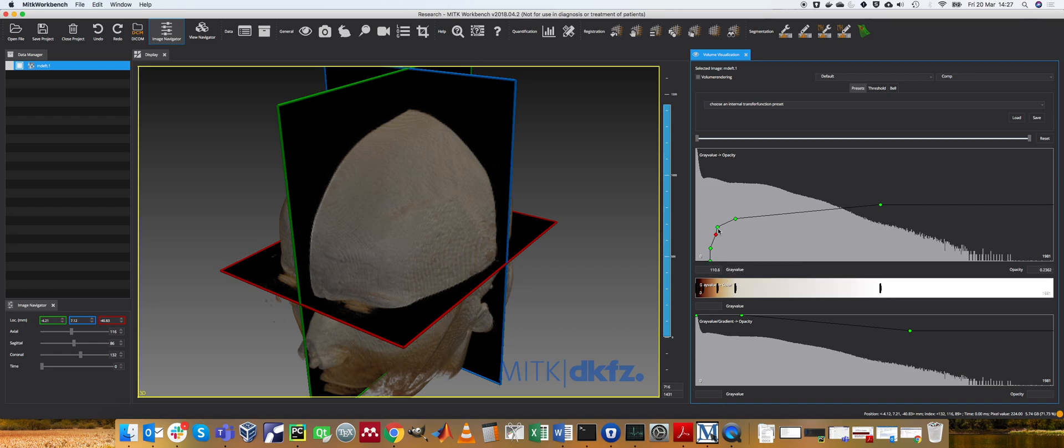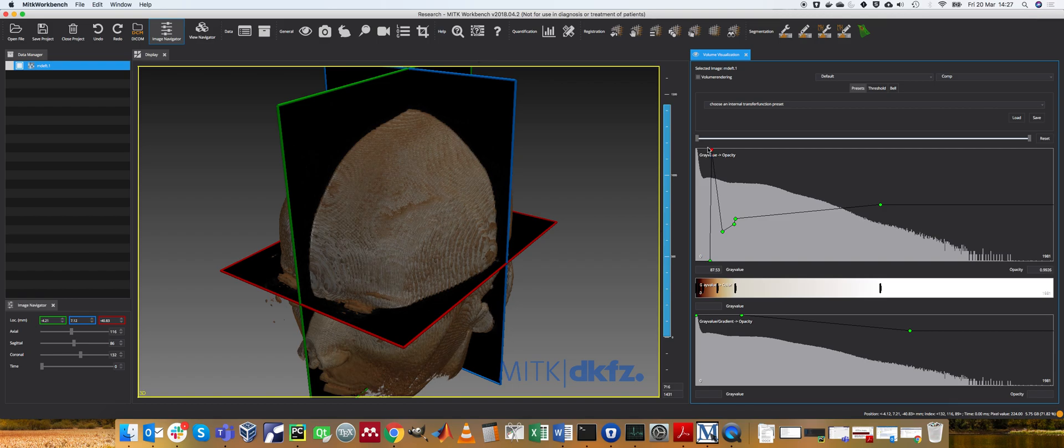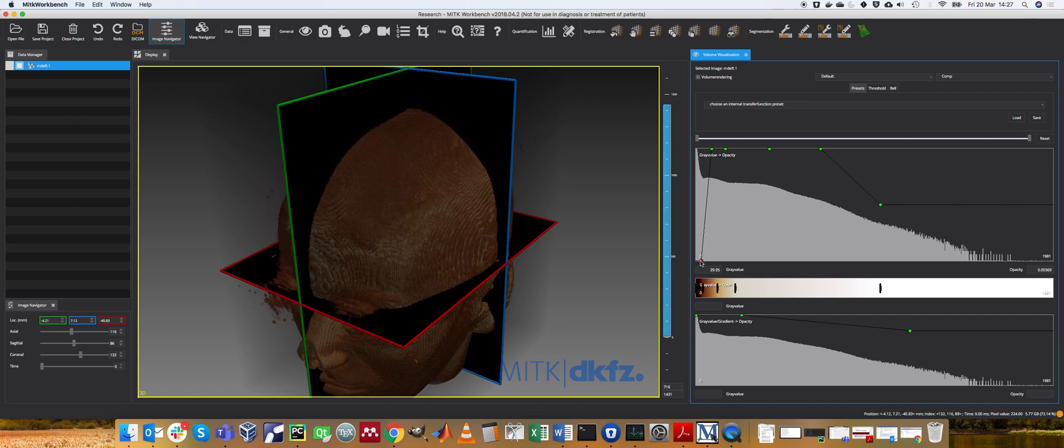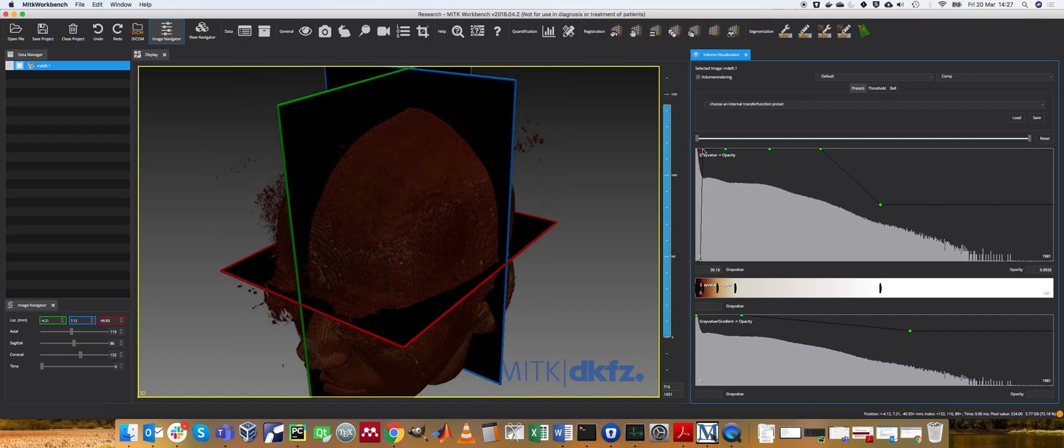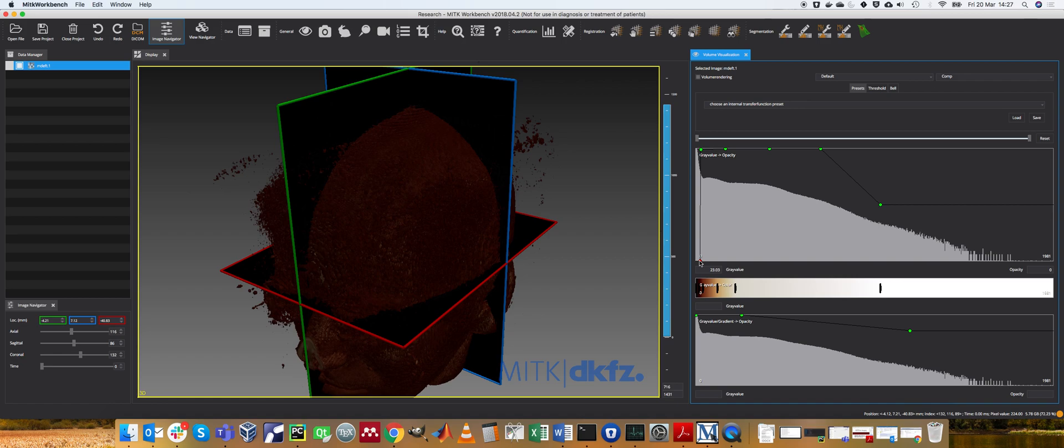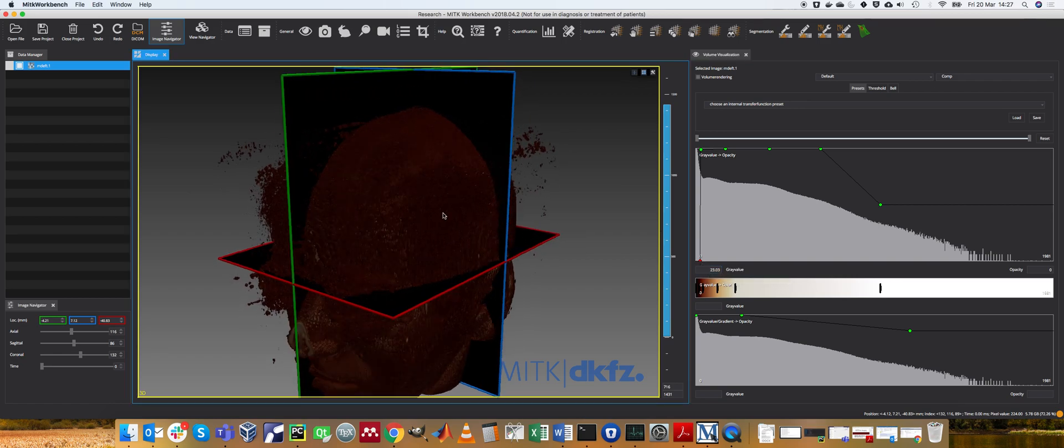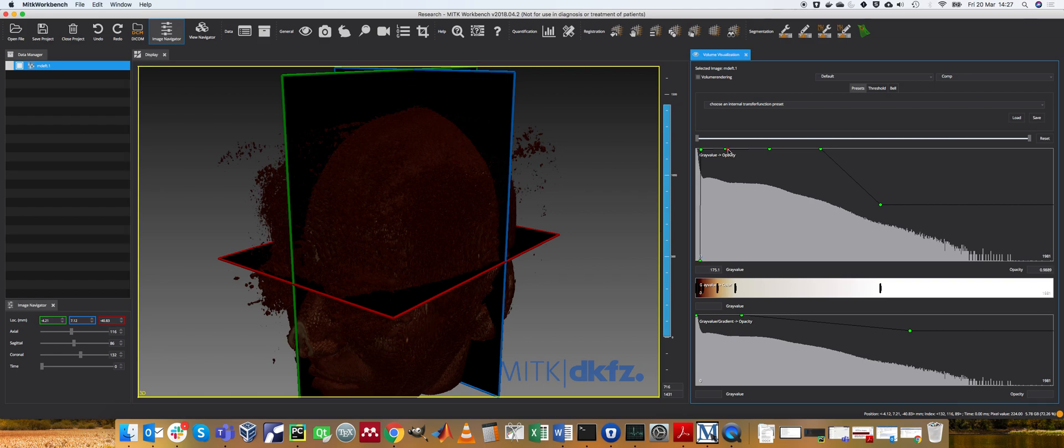So let's just for the sake of the example, let's make everything fully opaque, so non-see-through. If I move all of these down, do you see how all of the data, even the noisy background, is becoming non-transparent, which is obviously a useless rendering, but you get the point.